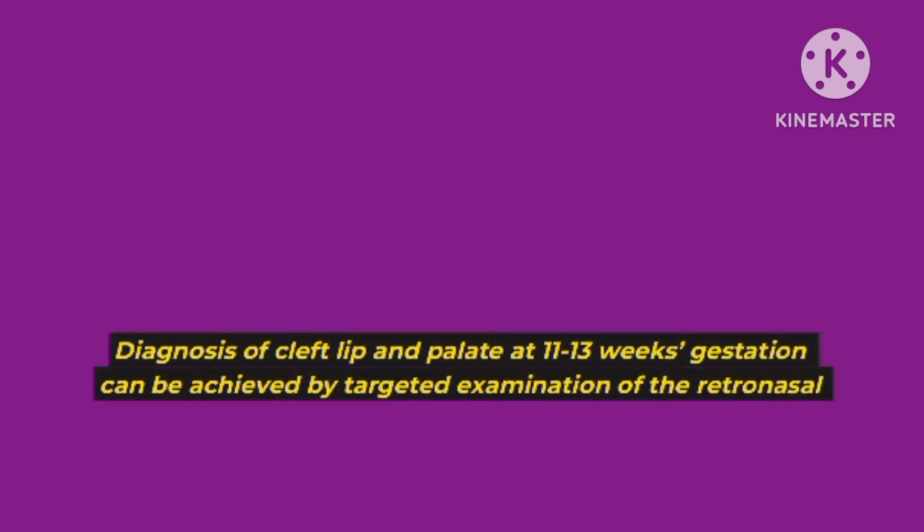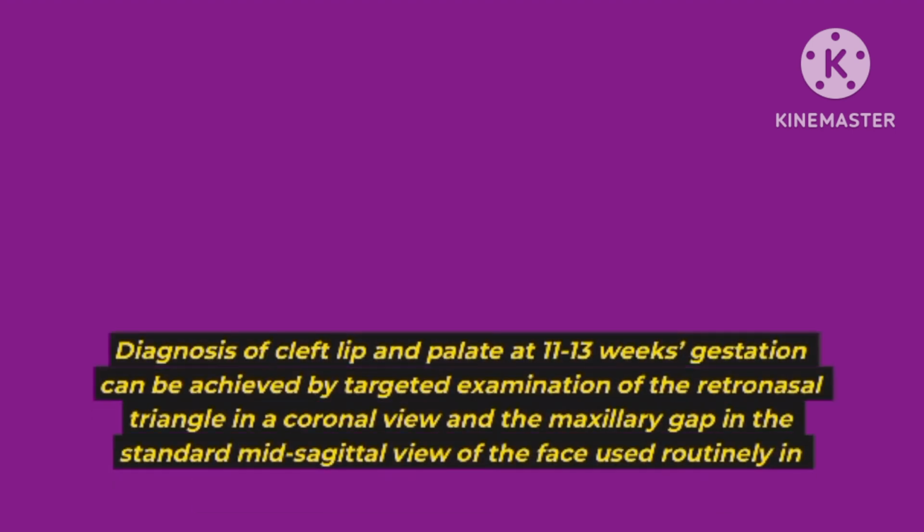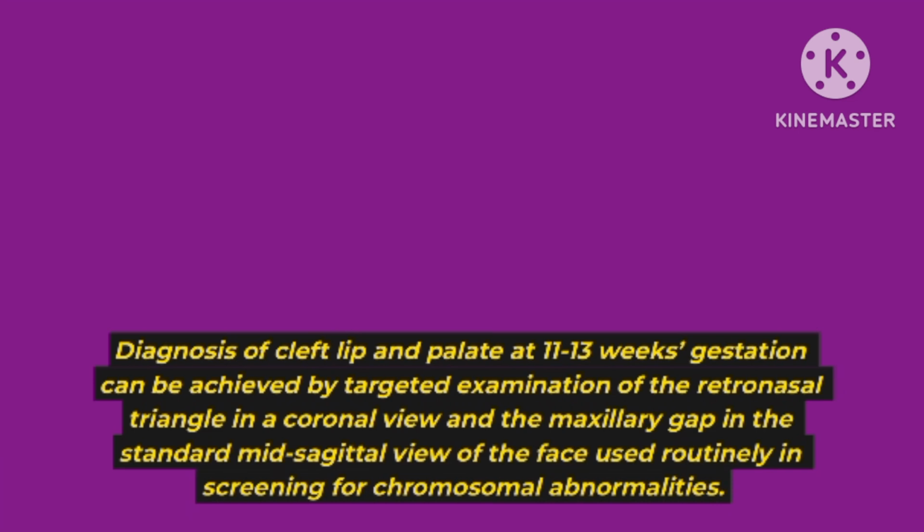Diagnosis of cleft lip and palate at 11 to 13 weeks gestation can be achieved by targeted examination of the retronasal triangle in a coronal view and the maxillary gap in the standard mid-sagittal view of the face used routinely in screening for chromosomal abnormalities.